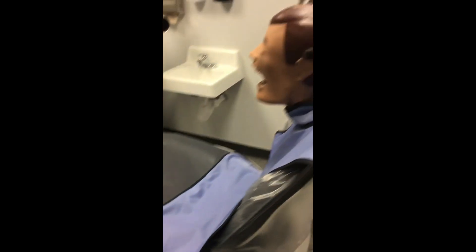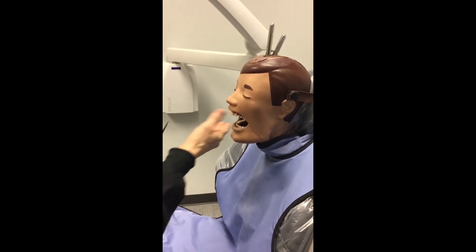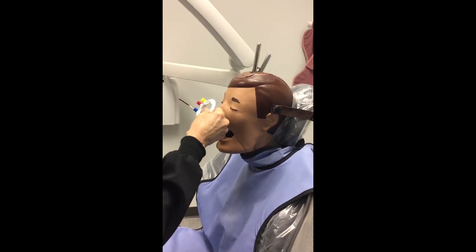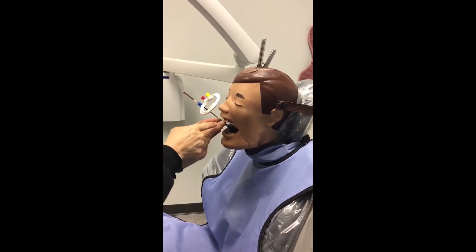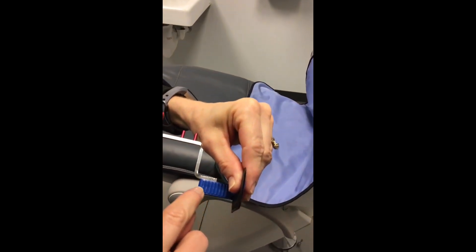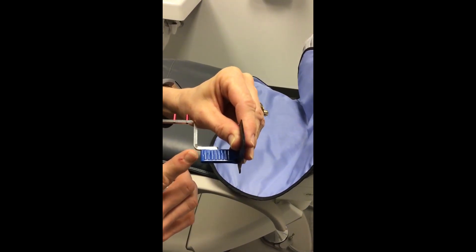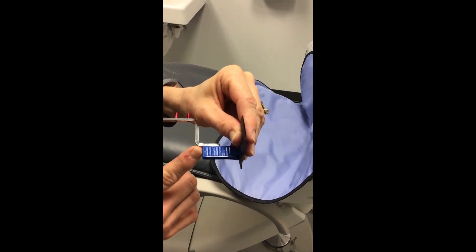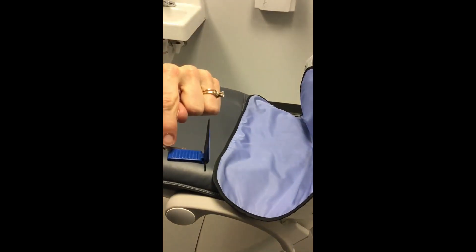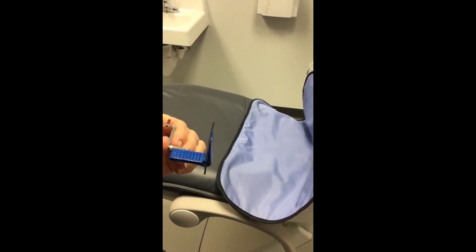Now we're going to demonstrate how to place the bite block in the mouth. Hold the bite block with your hands and get it inside the mouth against the palate. There is a line right in the center of the bite block that divides it, and you'll use that line as a guide to place your anterior projections. That line should go in between the teeth you want to appear on your sensor. For the maxillary central incisor, that line will be placed between teeth numbers eight and nine.